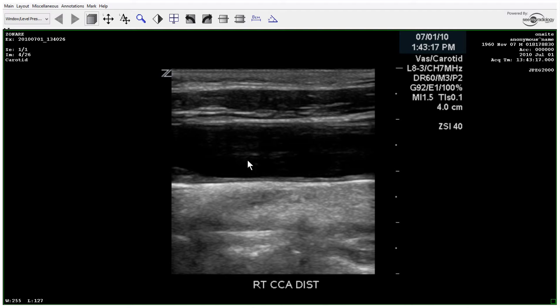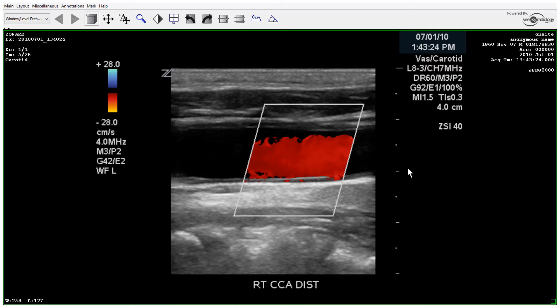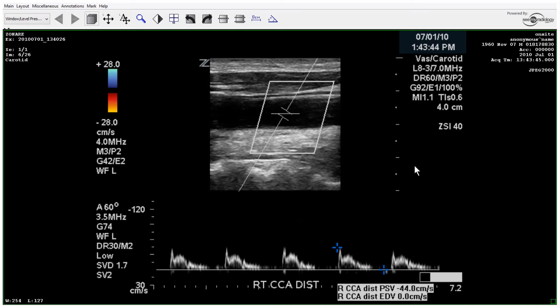Here's again the distal CCA. We could clean this up to get rid of the echoes within the lumen — you can see that is definitely artifact as the color fills the lumen almost entirely. We could probably turn the gain up slightly or decrease the PRF to make that fill. Look at this waveform again — we have an abnormal waveform.